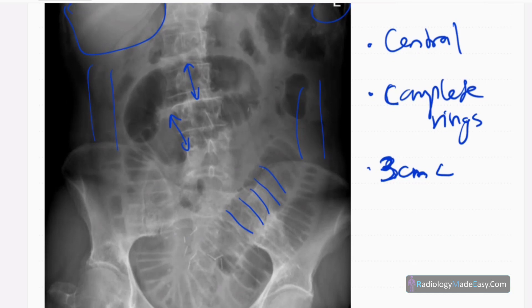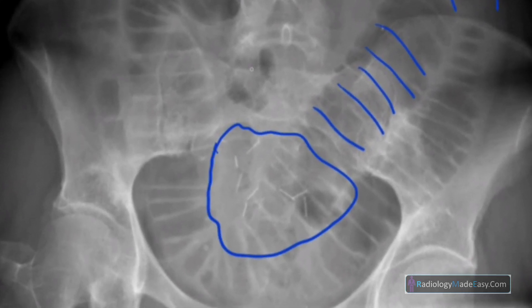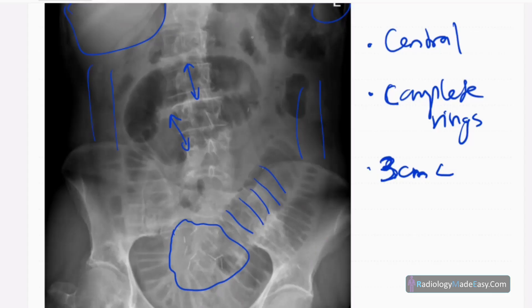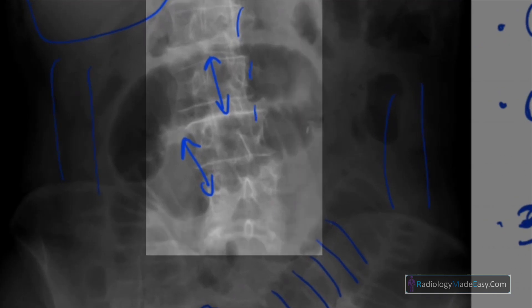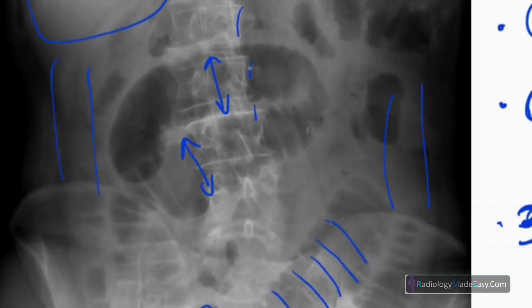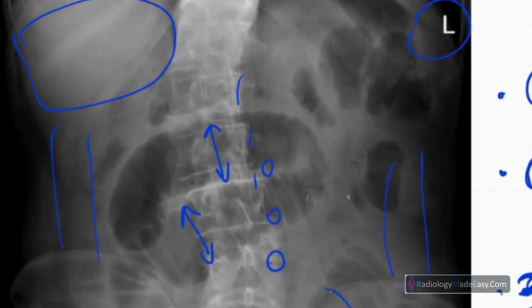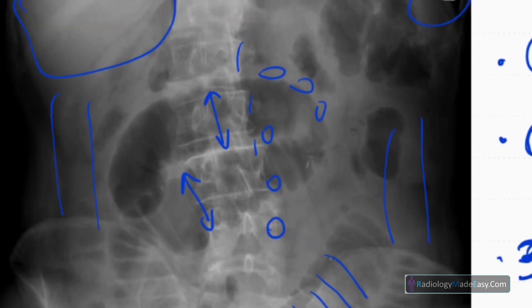You can see some linear opacities here — these are previous surgical clips, indicating the patient has undergone a prior surgery. There is also scoliosis in the lumbar spine with concavity to the left side and degenerative changes including osteophytes. There is no pneumatosis intestinalis — that is, no gas within the small bowel wall — so no complications from that.